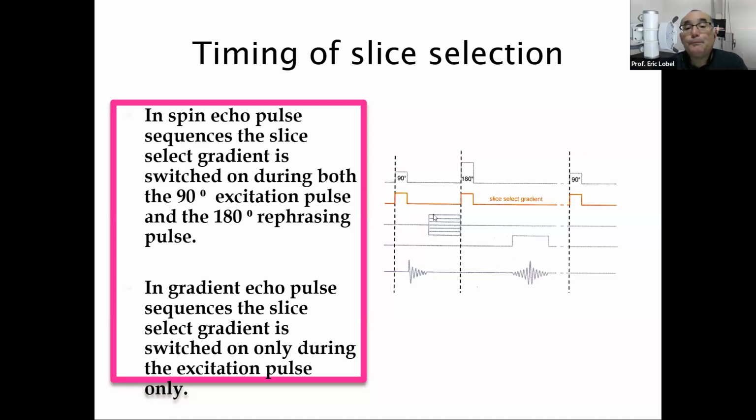Then we see our next step, which is what we're going to talk about next, the phase encoding. Going back up, the next step is a rephasing pulse. Again, the slice select goes on. Third step, looking towards the right, here's our frequency encoding gradient going on. That's our third and last spatial encoding step. It will read out the echo, which is why the frequency encoding gradient, and we don't know if it's X, Y, or Z in this illustration, is reading out that echo and is responsible again for the bandwidth.